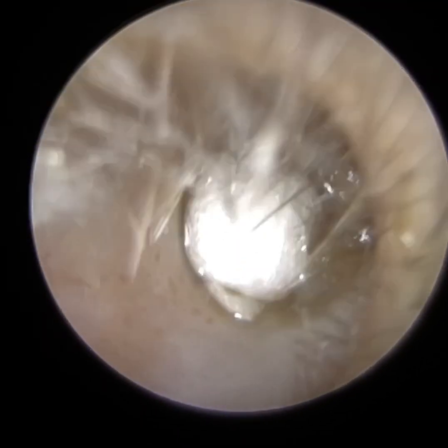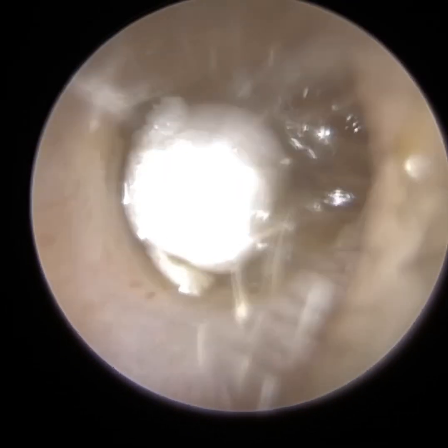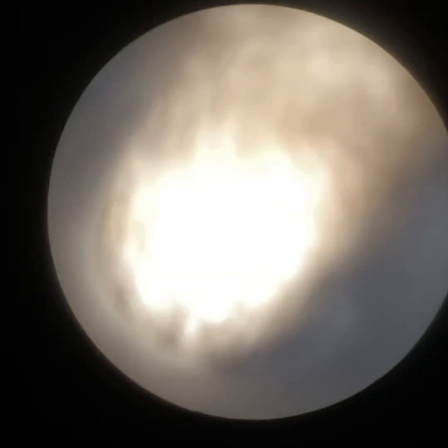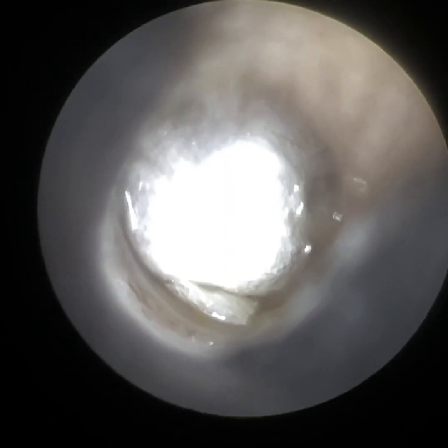Hi everyone, this is Mr. Neil, writer to consultant audiologist at Clearwax. Thank you for joining me in this interesting video. It's of a three-year-old child who attended with a piece of polystyrene packaging lodged deep in their right ear.